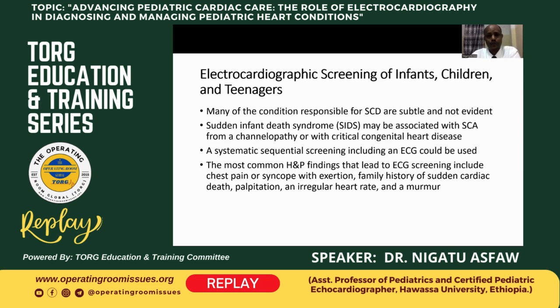We need to screen infants or other pediatric groups for rhythm abnormalities, and that can also give us insight if there is undiagnosed congenital heart disease, and this can help us in preventing sudden infant death syndrome, which may be associated with some rhythm abnormality resulting from channelopathies.